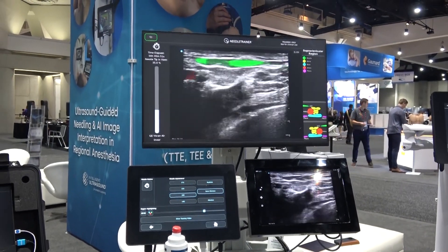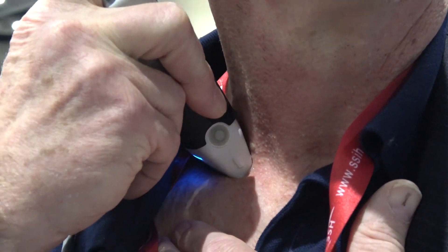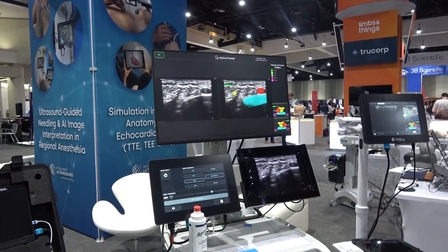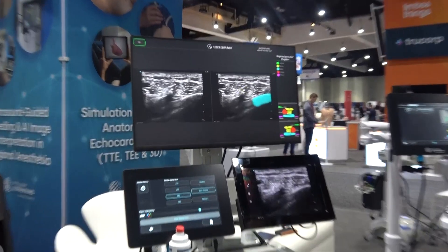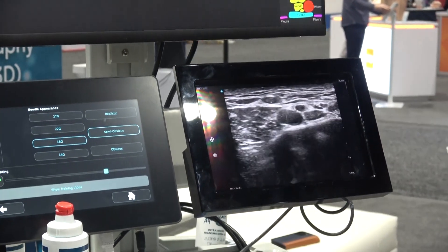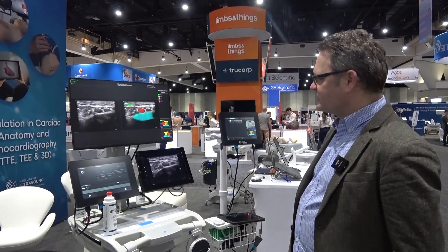What Needle Trainer does is help people learn the skills they need to carry out a peripheral nerve block. A peripheral nerve block requires a number of different skills — needle probe manipulation to be able to line the needle up with the probe, and also an understanding of the ultrasound anatomy. Most anaesthetists probably don't use ultrasound in their standard practice, so there are a few skills they need to learn, and that's where Needle Trainer comes in.